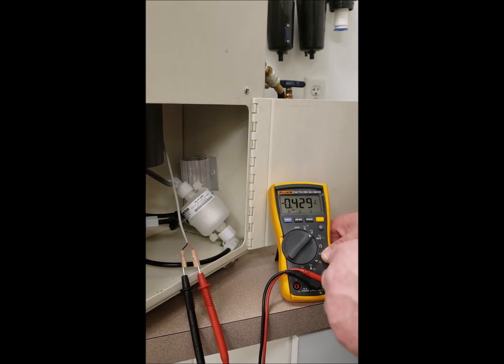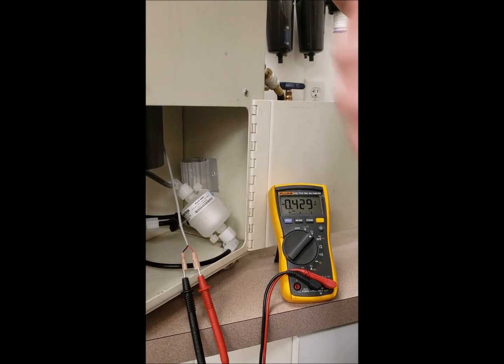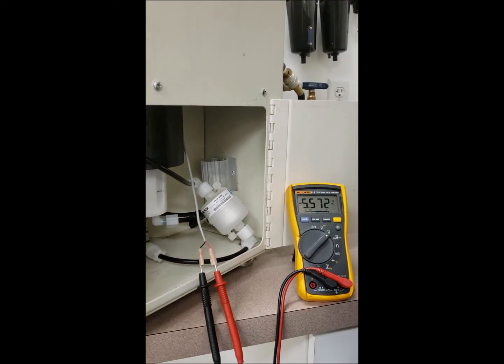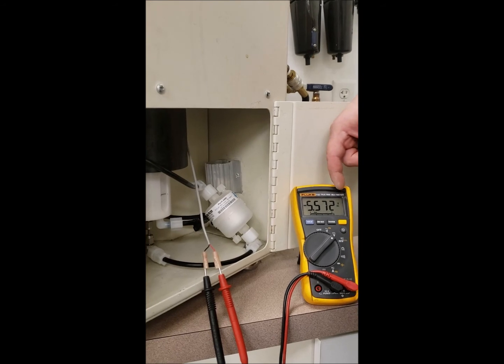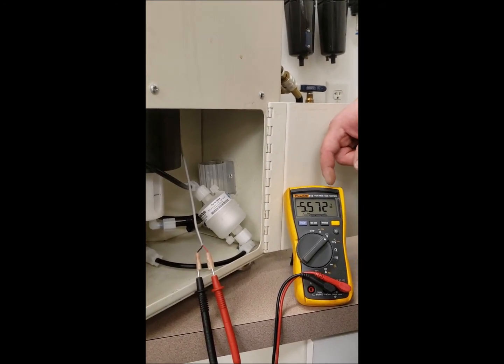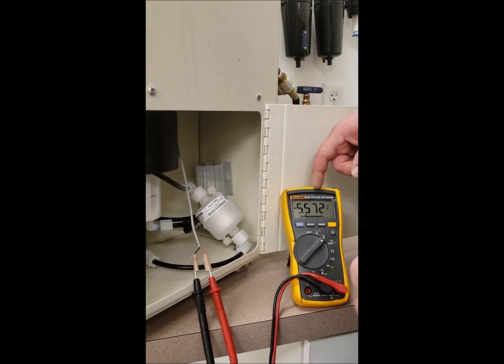What we're looking for is somewhere between 3 and 9 volts. You're going to turn the coating pump prime on. You should see somewhere around 5 volts on average. You'll get somewhere around 3 volts on the low end and 9 volts on the high end.